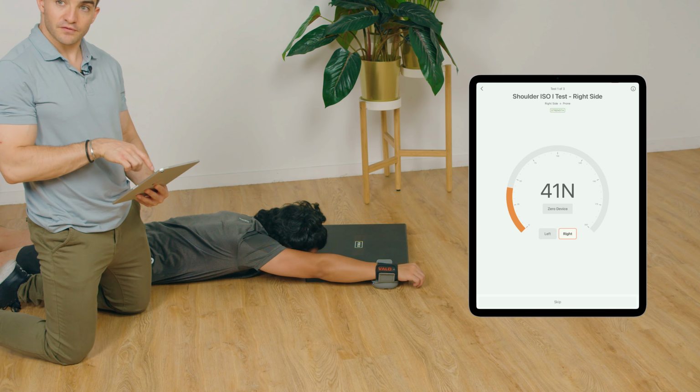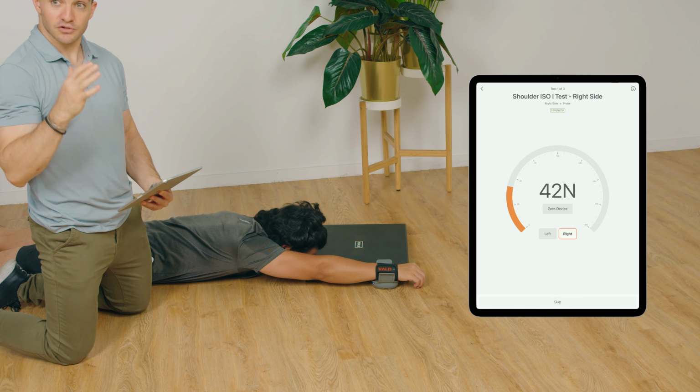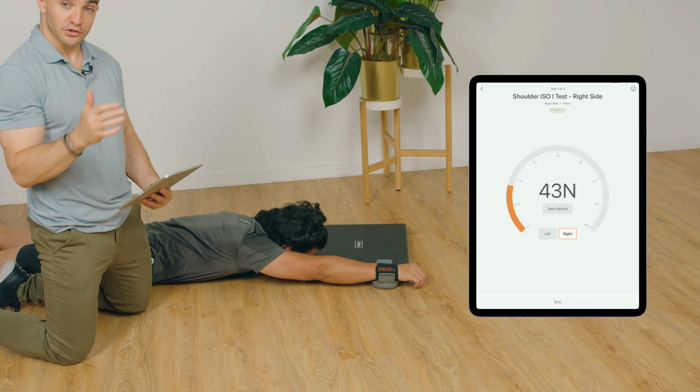Now, there's a certain amount of force being applied. I don't zero it because this is some of the force that Cal's already applying into the Dynamo, and I don't want to lose that in my measurement.